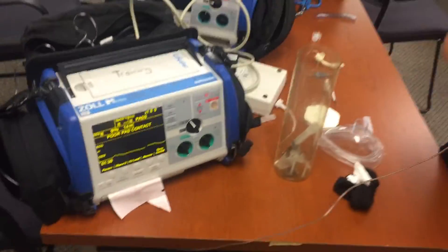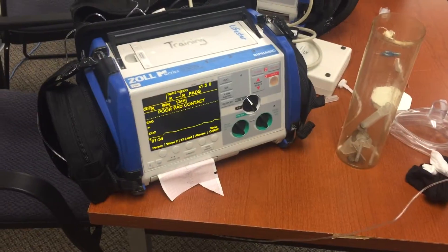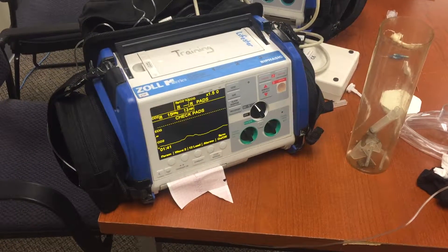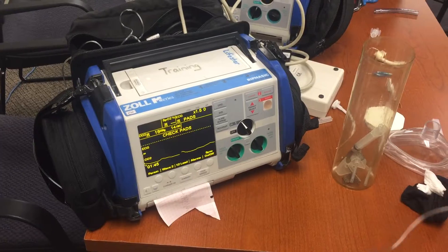Alright, so let's deflate it and we'll have it come back. Sounds like it's still partially inflated. Could be. You got the speaking valve on there?